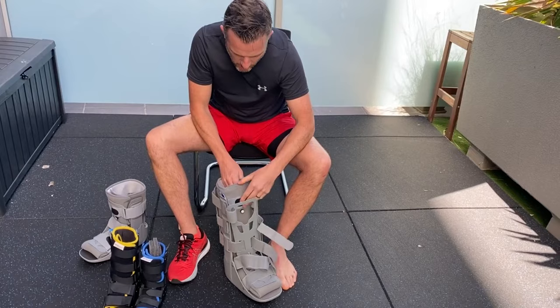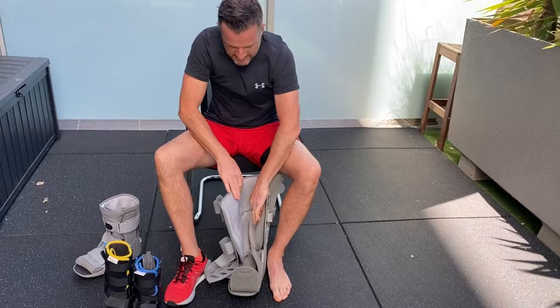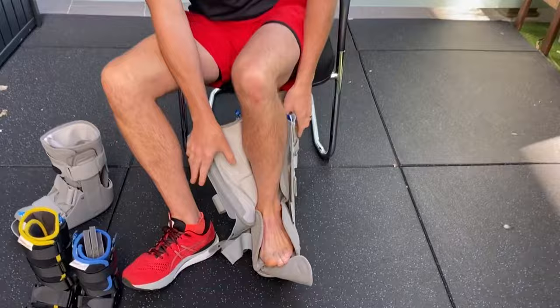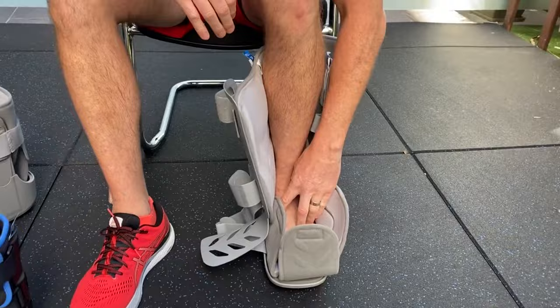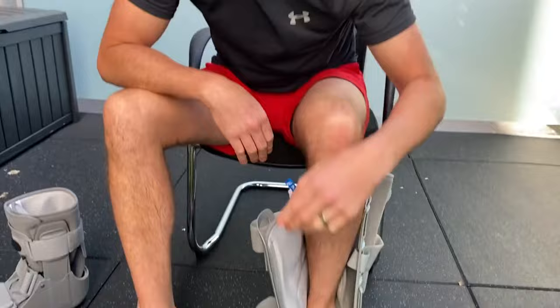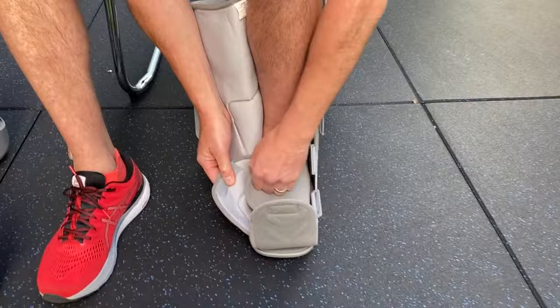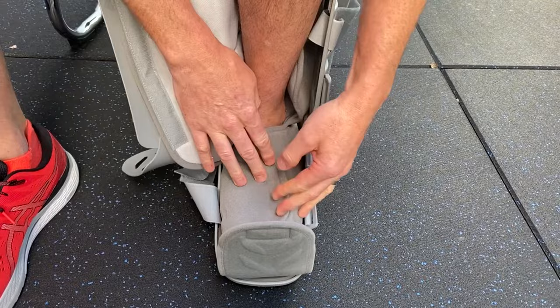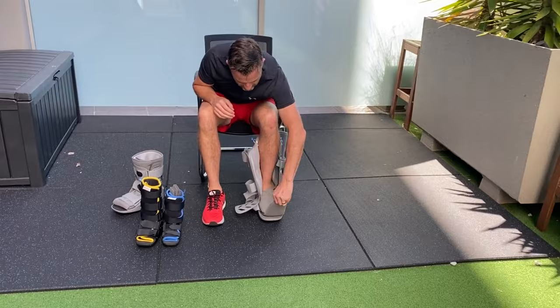Loosen everything off and get your whole foot right to the back of the boot — not so you're hitting the plastic, but nice and snug. Make sure you've got the right size: when you close it up, your toes shouldn't hang over the edge. I'm in a large because I'm a size 12. Your whole foot needs to be protected by the shell.